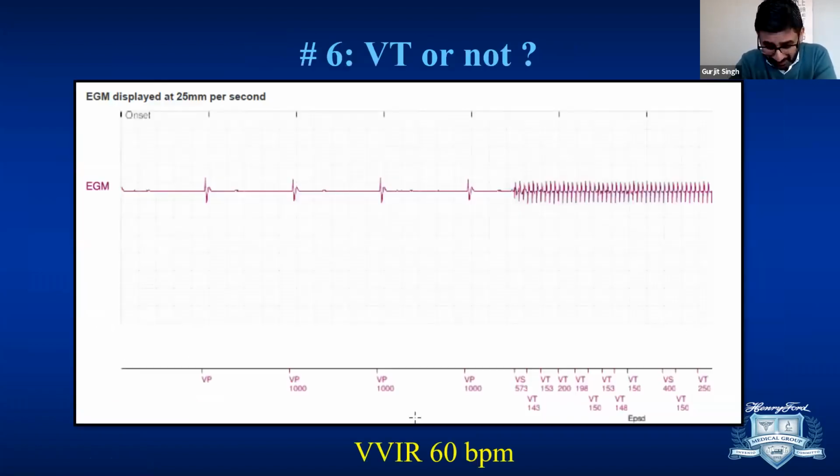Okay, next case is a patient with a ventricular pacemaker, and you can see the patient is being paced at 60 beats a minute, and then something else happened at the end. Anybody want to take a guess what this is?